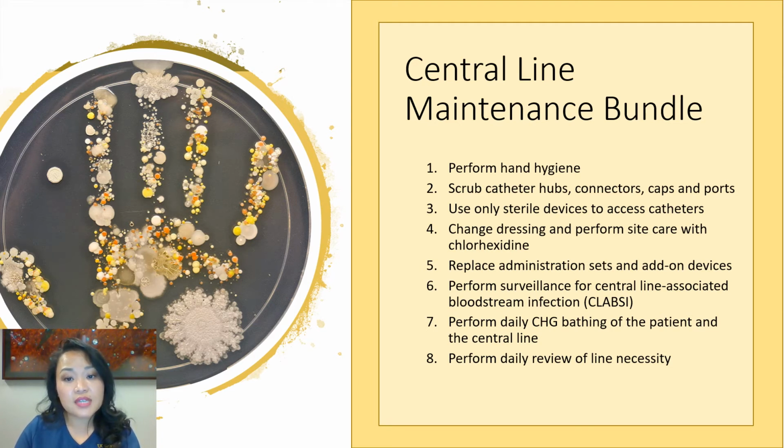The 8 components of the central line maintenance bundle are listed on the screen for you. I'm not going to go over and read every point for you, but take this time to go ahead and read through the 8 components.